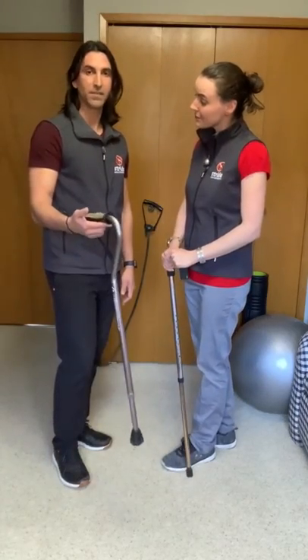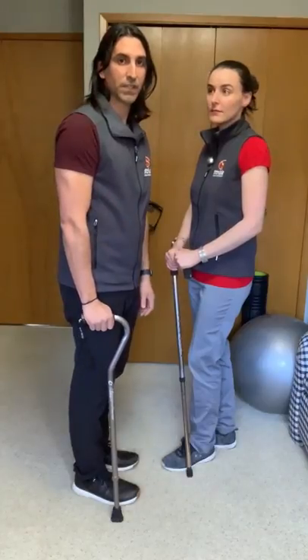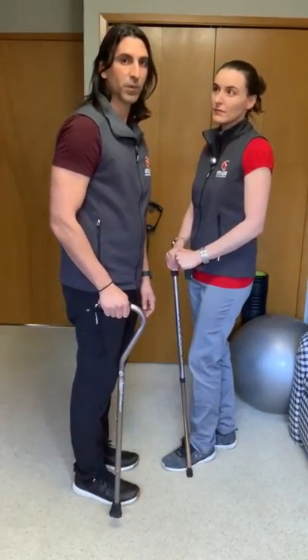In my case, my cane is too short. If you see, my elbow is completely straight. We need those 20 to 30 degrees to be perfect for me.